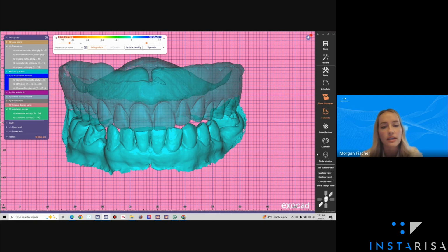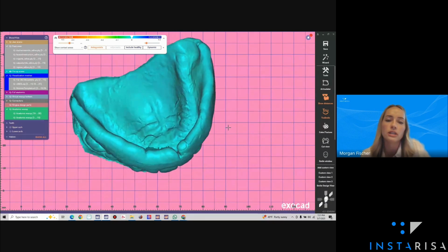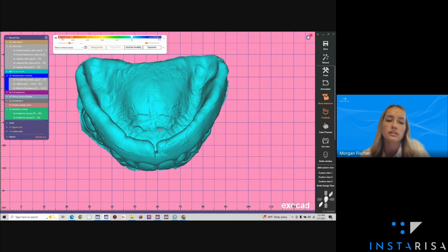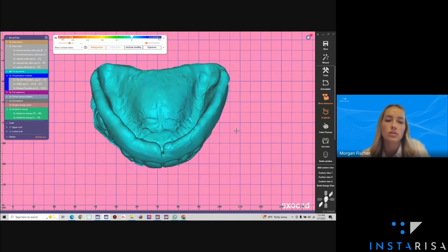We pretty traditionally like to open 1 to 2 millimeters on any crown and bridge case, because essentially that means we get to prep a little bit less. And he also took a 360 scan of the patient's upper denture with a really nice denture wash, so that on the day of surgery, I can see all of this nice tissue references. I can see the rugae here. I can see the maxillary tuberosities, so that I know on the day of surgery I will have good soft tissue alignment after he places his fiducial markers.